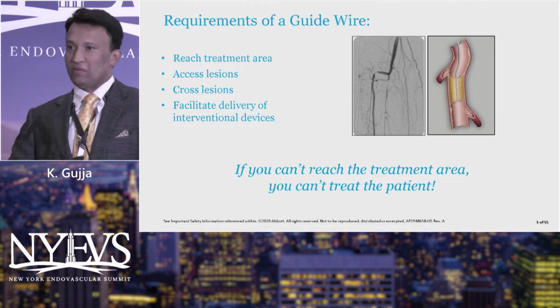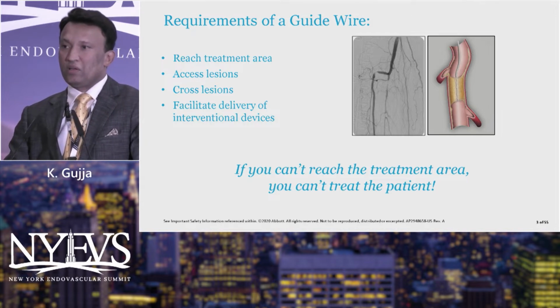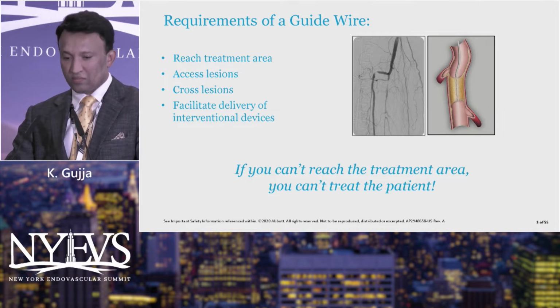Again, most of the tibial vessels are pretty angulated. Even the iliacs are very tortuous. So SFAs are usually pretty straightforward to go through, at least angulation-wise, unless you're trying a CTO through the profunda, then it becomes difficult again.